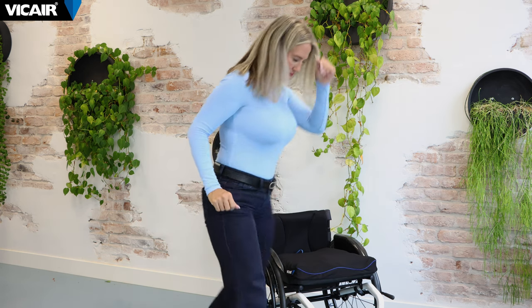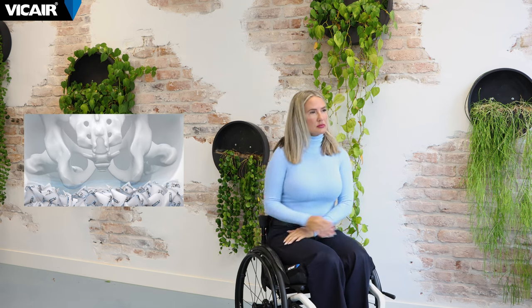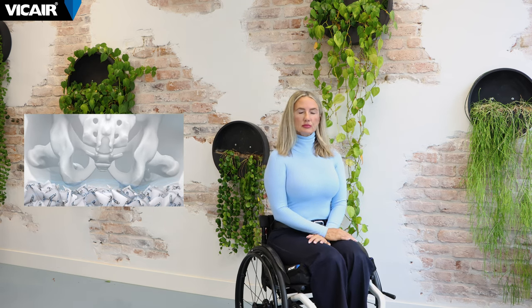Sit on the cushion for a few minutes to allow the cushion and the smart cells to adjust to the shape of your body. If necessary, adjust the footrest of your wheelchair. Your feet should rest on the supports while your thighs make full contact with the cushion.